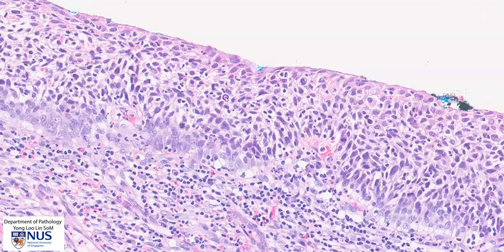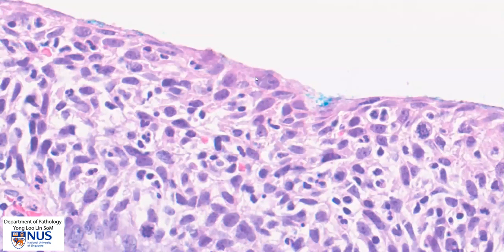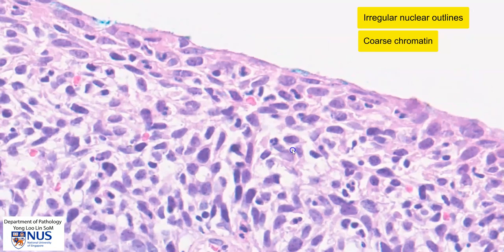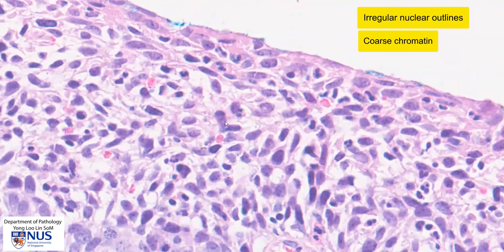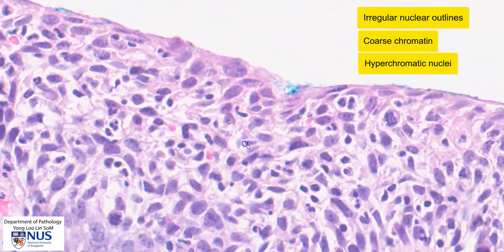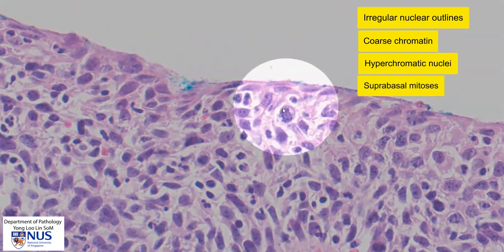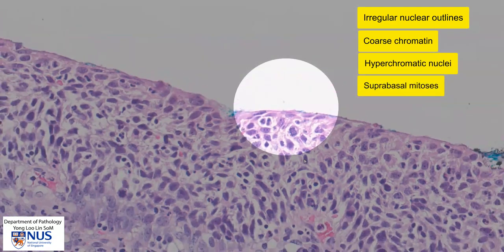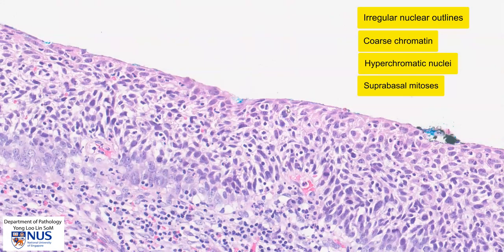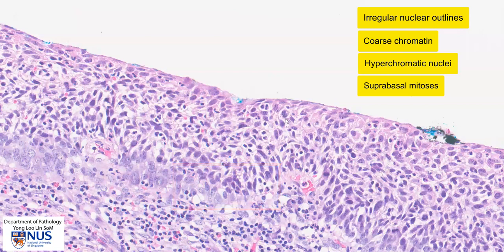Looking at individual nuclei, we can see that the nuclear outlines are quite irregular and the chromatin is coarse. Here again we have irregular nuclear outlines and quite hyperchromatic nuclei. We also have mitotic figures, and this mitotic figure is located very superficially, almost right at the surface of the squamous epithelium. In benign squamous epithelium we may see some mitotic figures close to the basal layers, but generally not above the middle half. The presence of mitotic figures in the middle and more superficial regions of the stratified squamous epithelium is usually a sign of dysplasia.